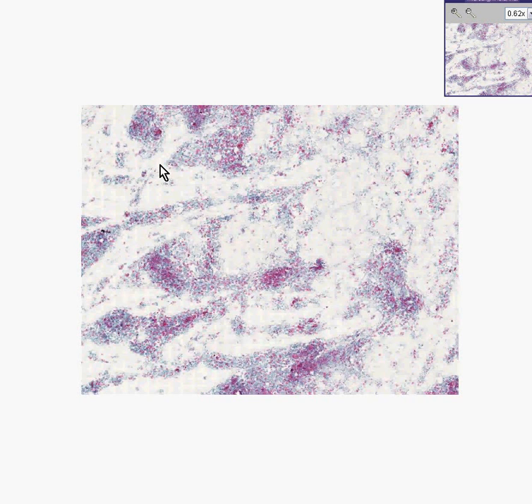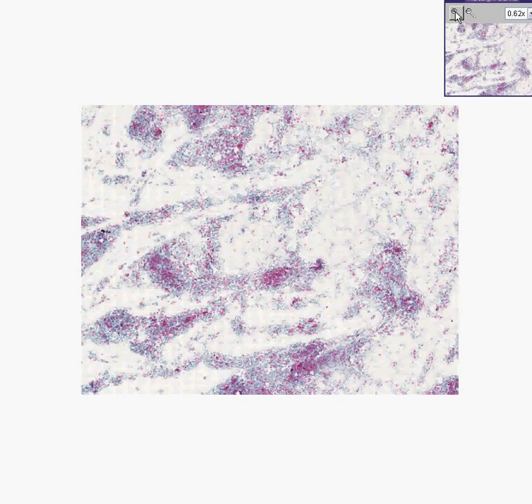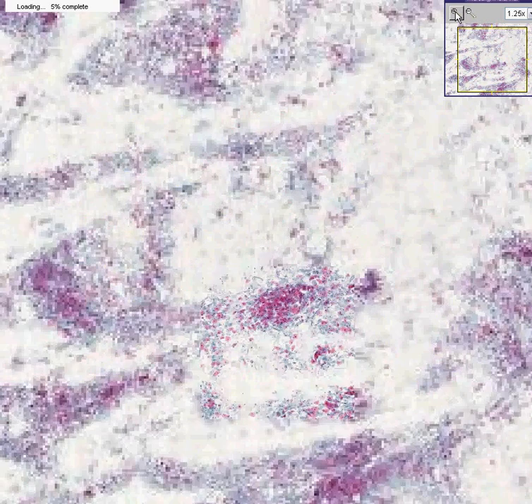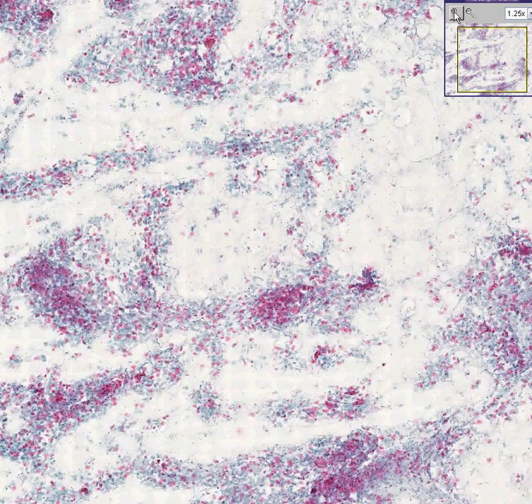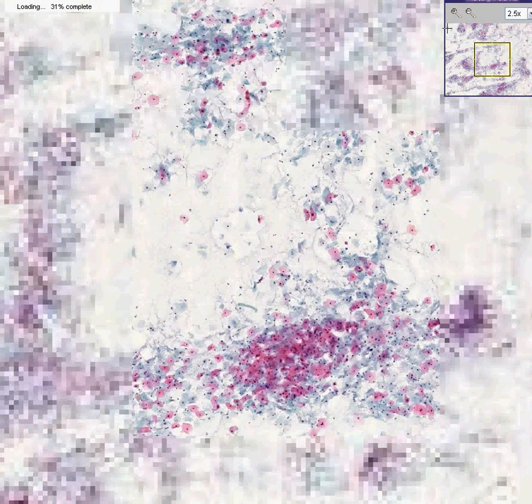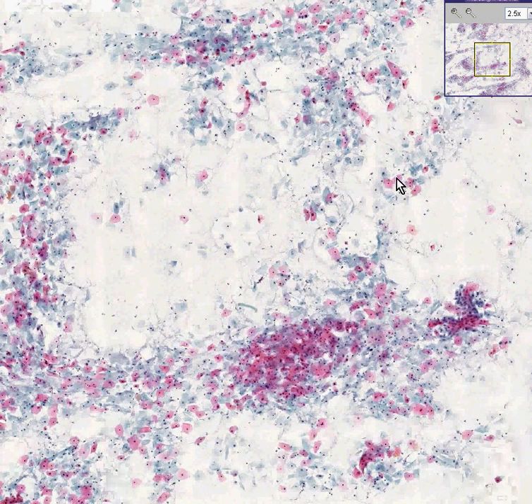Here is our third case of high-grade SIL, or high-grade squamous intraepithelial lesion, from the cervix. Notice this is purely a pap smear, and you can already start to see some of these orange cells.